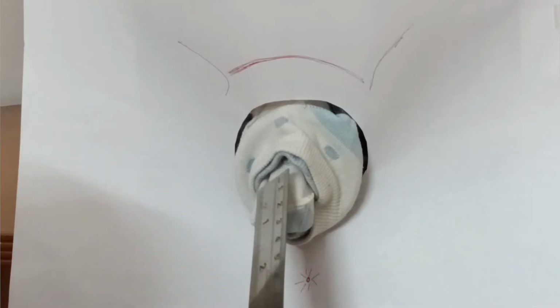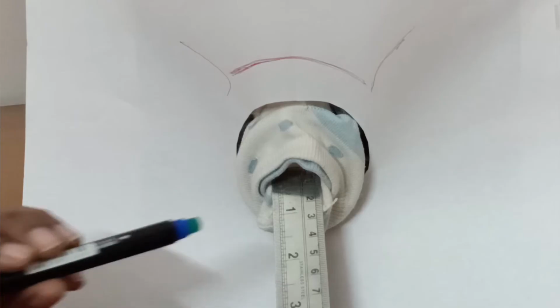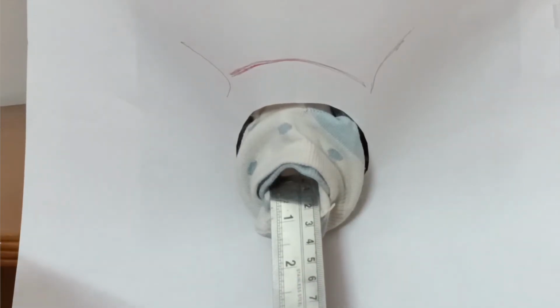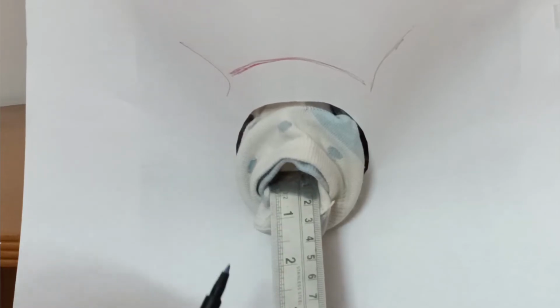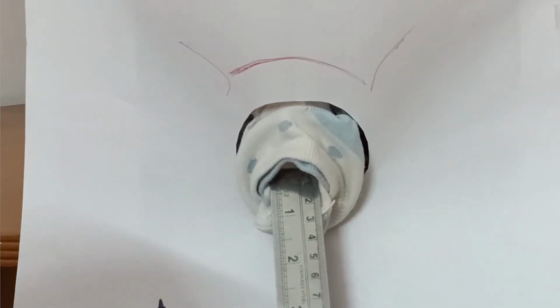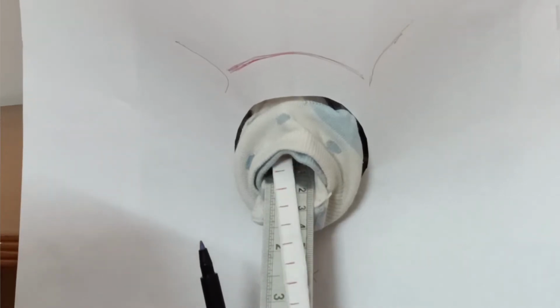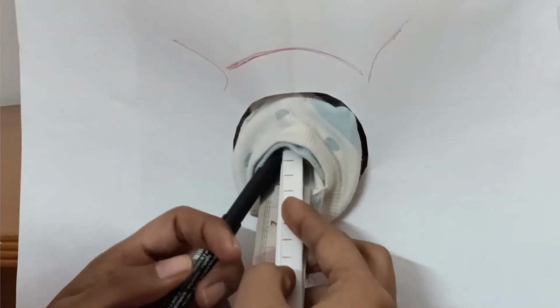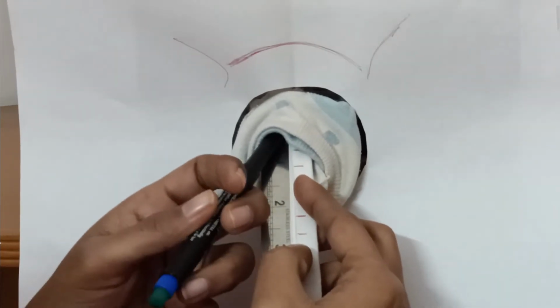So you require to depress the prolapsed portion and visualize the anterior vaginal wall, and then you mark 3 centimeter above, right? You go 3 centimeter above with the scale, and then you mark inside the prolapsed portion.